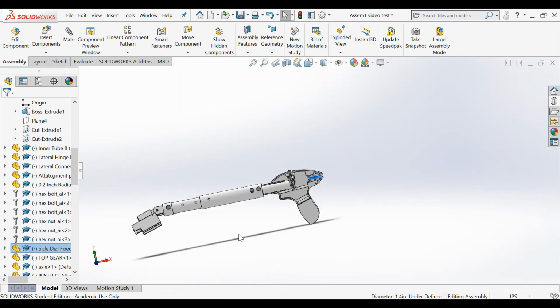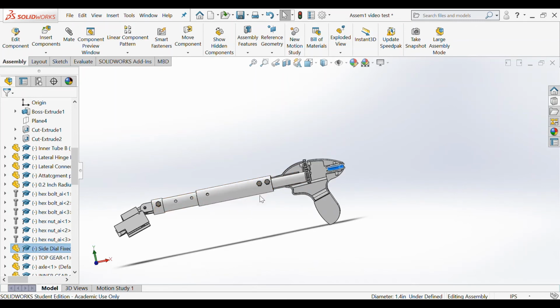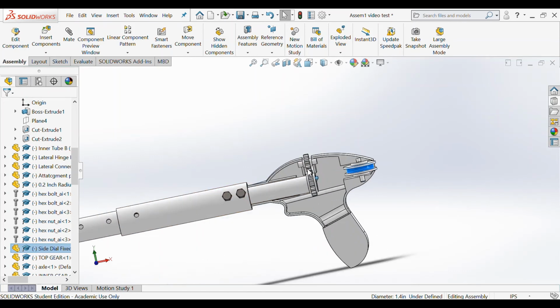Next, I'm going to mate the inner components to the rod itself in order to create that 360 motion. So all of these components will move according to the movement of these gears.